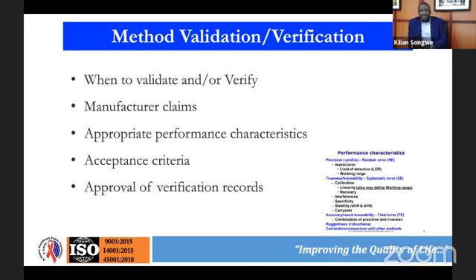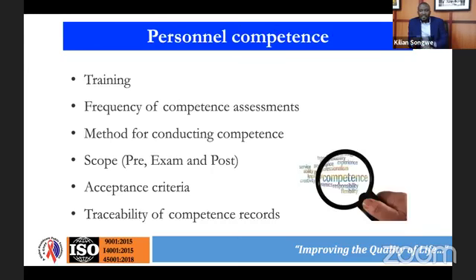But another important thing is not everybody approves the verification report. You have to make sure that whoever approves the verification record is competent and actually has the best interest of the patient at heart. Because you might want to accept something just because it has been pushed onto the lab, you have no other options, but that is one thing that the lab has to look at: who approves verification reports. They have the right competencies and the right criteria.